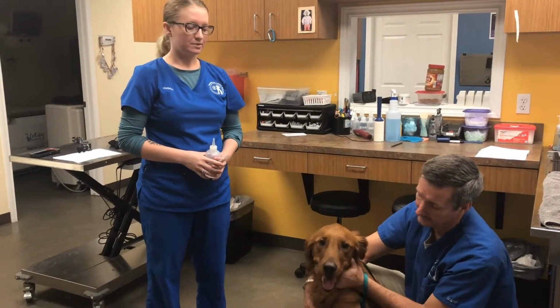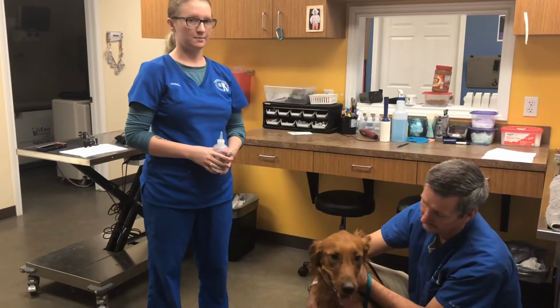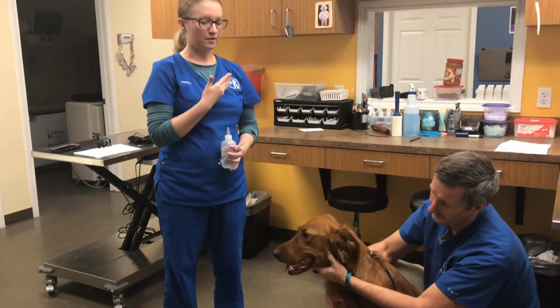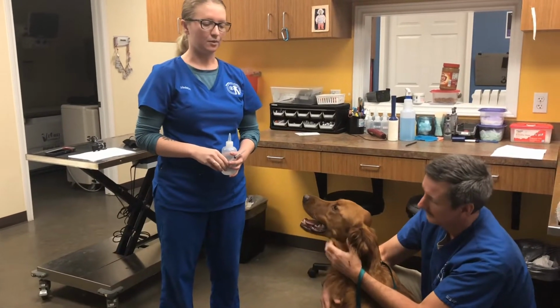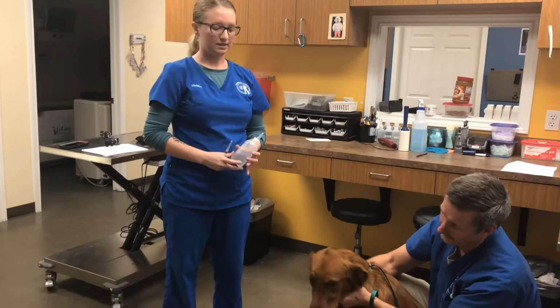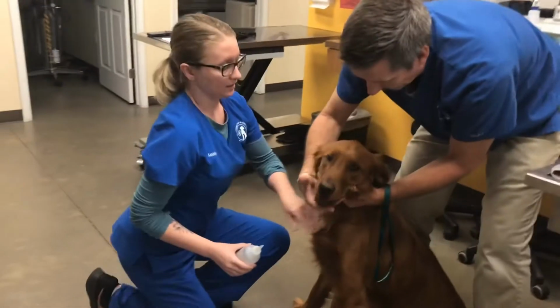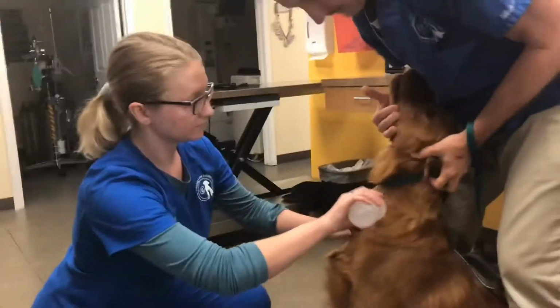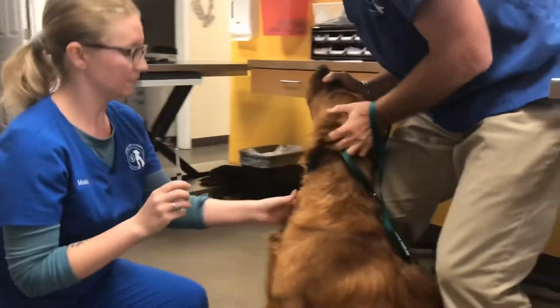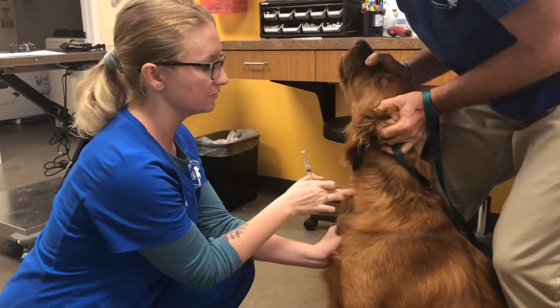Okay, now I will be demonstrating a jugular blood draw on a canine patient. My restrainer is holding him in sitting sternal recumbency. He'll hold his head up out of the way so that I can feel his jugular vein, but I'm going in with the same 3 cc syringe with a needle attached to it, and then I'll apply alcohol first to sterilize my site and help me visualize his vein. I'll occlude the vein by pressing my fingers down into the jugular groove.